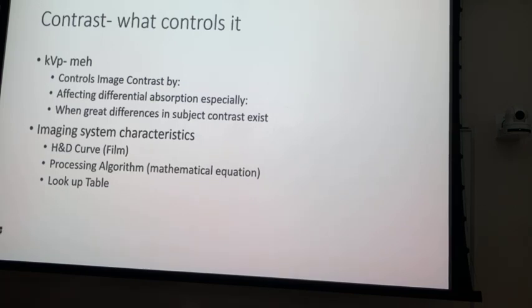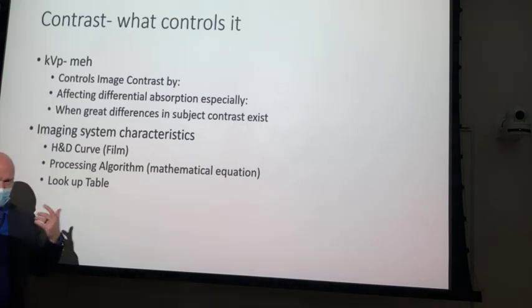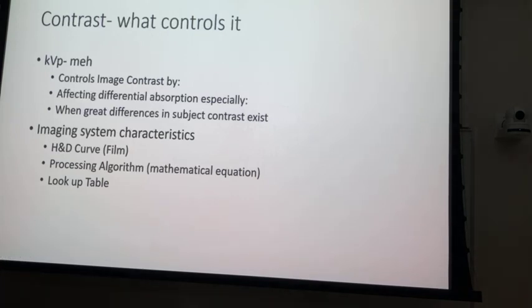And since the stored lookup tables, the algorithms inside the computer, are just these graphs of lines representative of densities, it's hard to make sense out of it. So we still use the H&D curve, and we use it to identify the imaging characteristics of the lookup table.